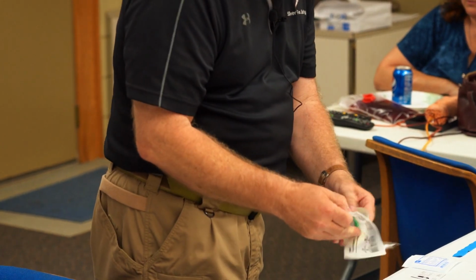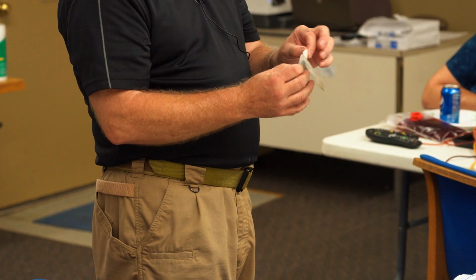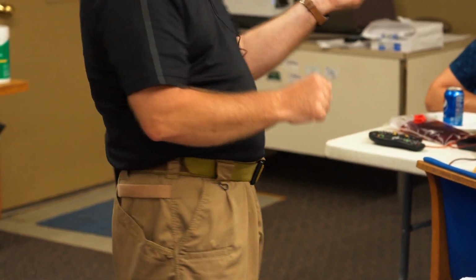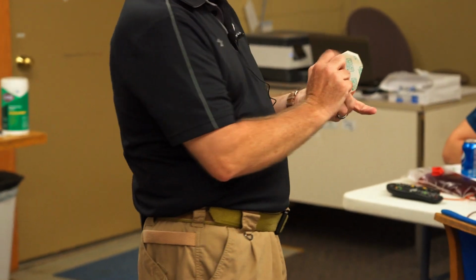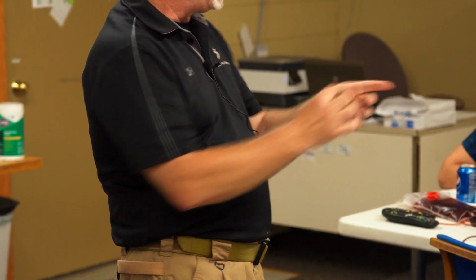So this is out and ready to go, and even here, it's a lot easier to start grabbing edges when you have your gloves on. Or you, my partner, are going to be able to get some of that prepped. EMR can be getting this part ready. Absolutely. Depending on what you're thinking, you may not even want to open this up. But in any case, those are the different pieces of that. Okay, moving on to the next piece.